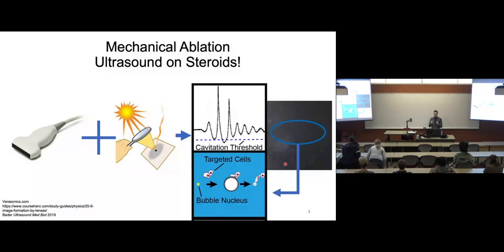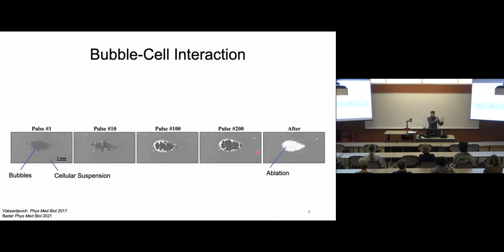And so what's happening here is that the tension of the pulse is sufficient to take the water from its native liquid state and transform it to generate this vaporous cavitation bubble phenomenon. And we know, so here this is a tank of degassed water. We know because of the similarity in acoustic properties between water and tissue that very similar things are happening in tissue, and that's causing the breakdown of cells, the ablation of cells. And that's demonstrated very nicely here.